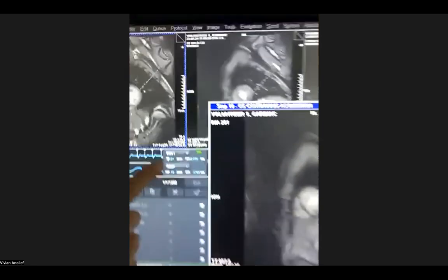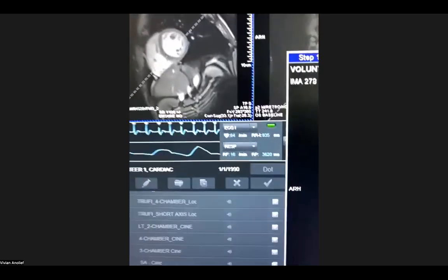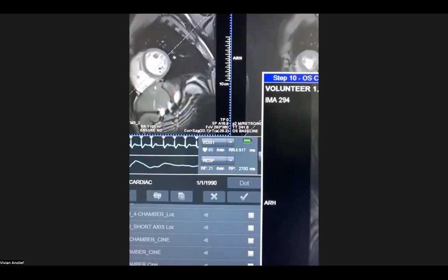Sorry. So here we started at 59. We can see it's going up. I can see his chest moving. Fast. Deeper. And fast. Deeper and fast. You see.